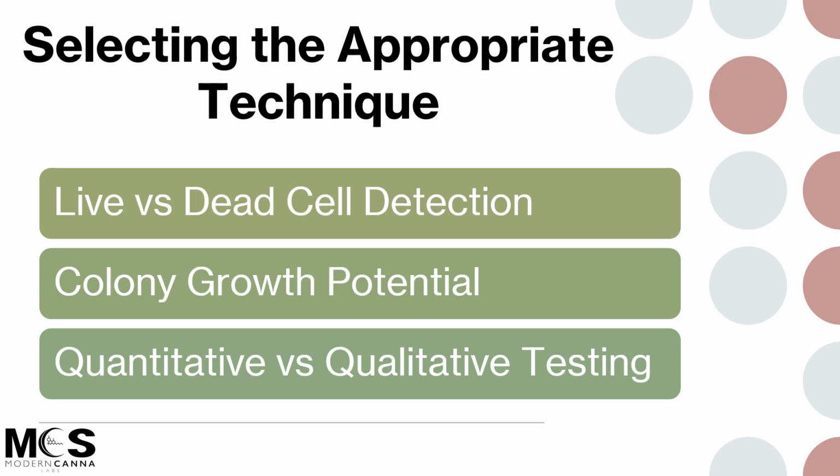Therefore, if that analysis is too rushed, there really is a chance that a false negative may be reported. And this is an argument that has been made for microorganisms such as Aspergillus that can take 5 to 7 days to grow on plates, however, can be processed via PCR in about 24 to 48 hours.